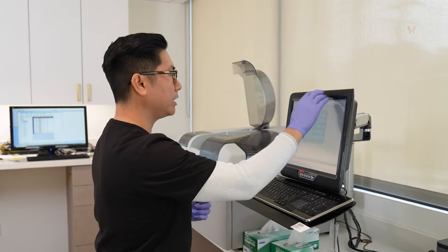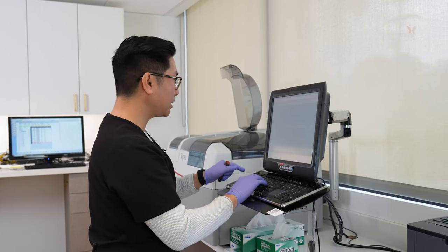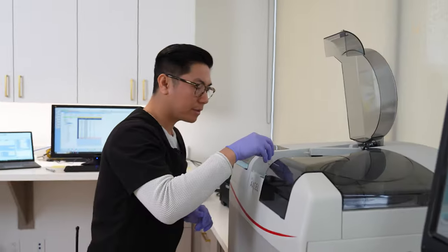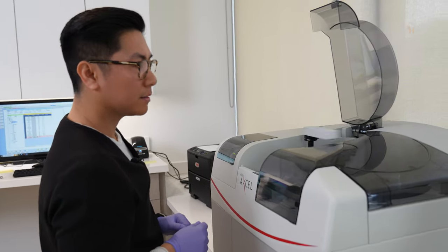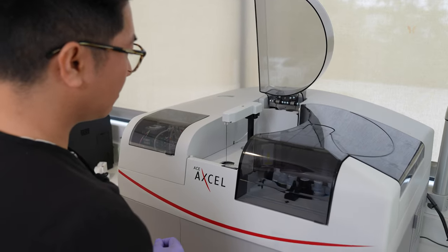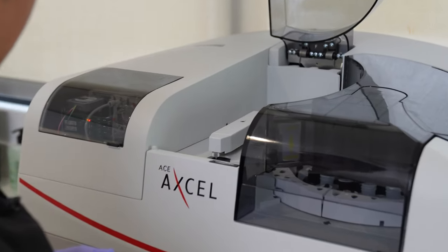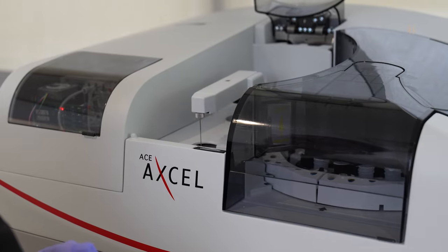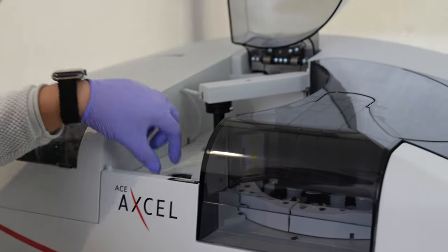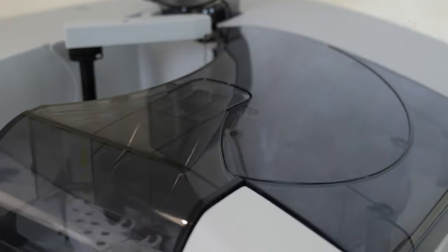Same as with the other machine, I'm entering the patient's information, and once it's in, we can just run the blood sample. I'll put the sample on here, a probe will go down and collect the sample, and a few seconds later that's all it needs from me. Right now the machine will do its thing — it'll take about 15 to 20 minutes, and we'll have results ready.